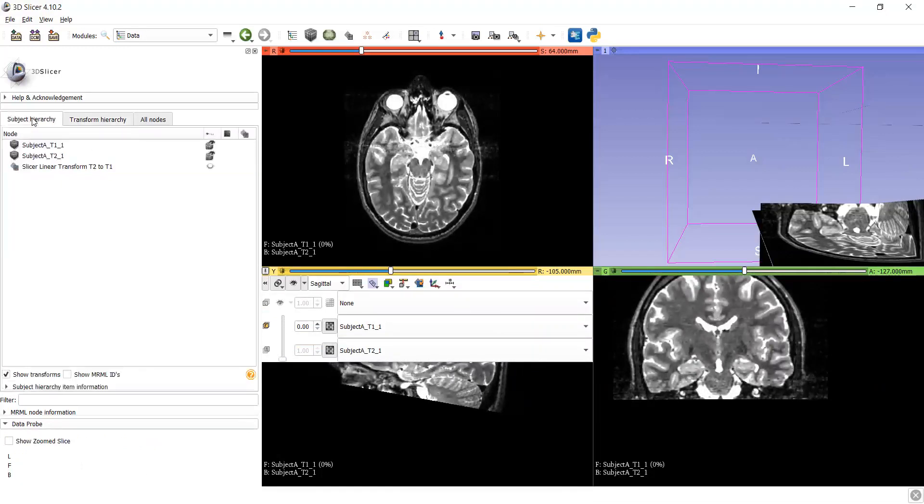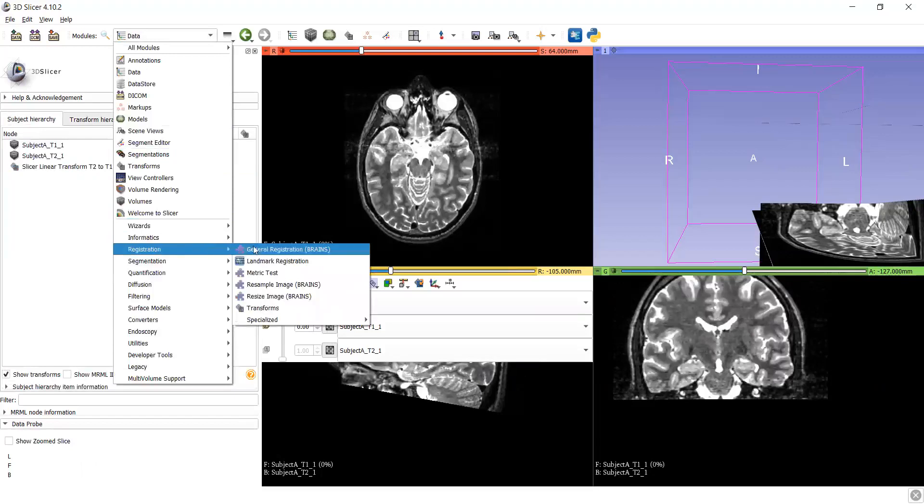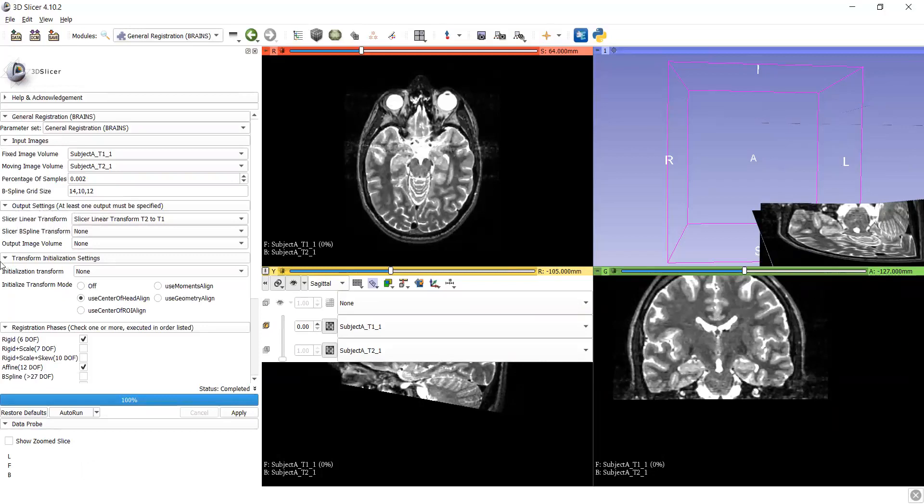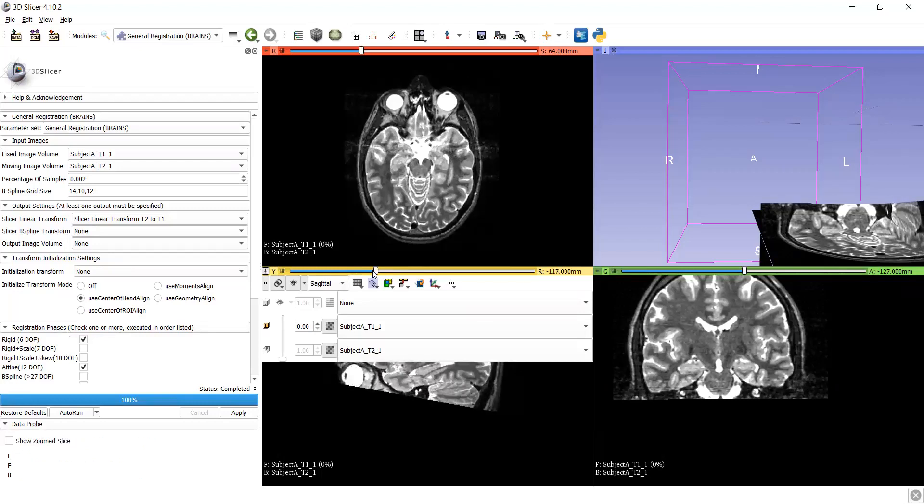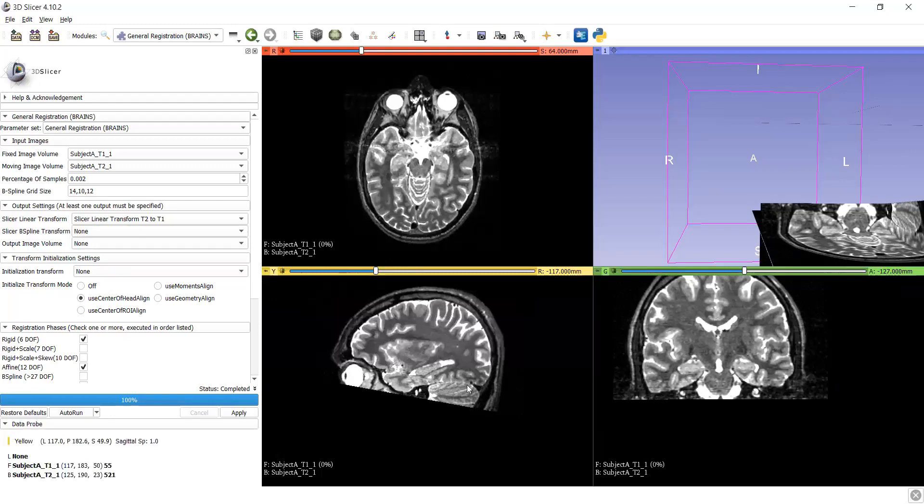So by this, with the help of this registration module, general registration by changing the output setting and using settings, registration page check, we can alignment the two different images in same alignments. So thank you.